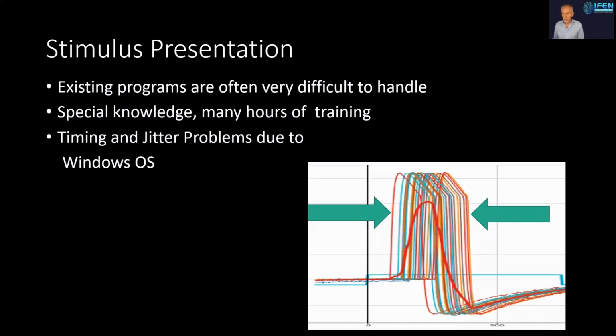The jitter produced by Windows cannot be accepted and generates inaccurate results. Therefore, a technology called transistor-transistor logic is needed to get accurate data. Our system addresses cognitive event-related potentials at first, like measures for P300, MMN, FRN, ERN, CNV, and others.